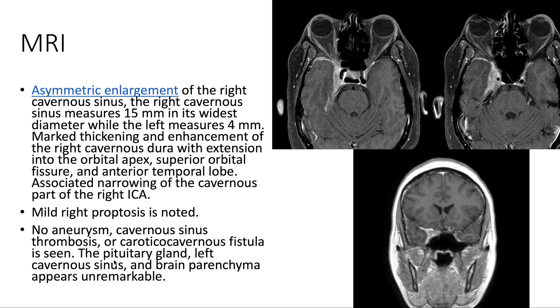On MRI, we see marked thickening as well as enhancement of the right cavernous dura, with extension into the orbital apex, the superior orbital fissure, and the anterior temporal lobe.